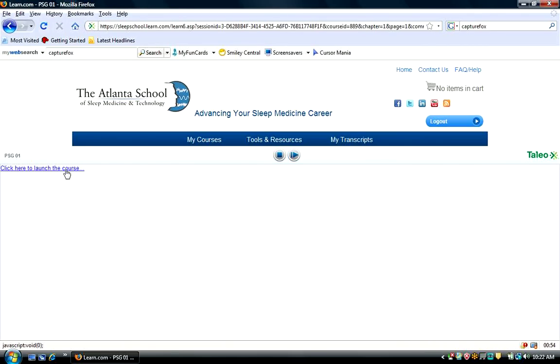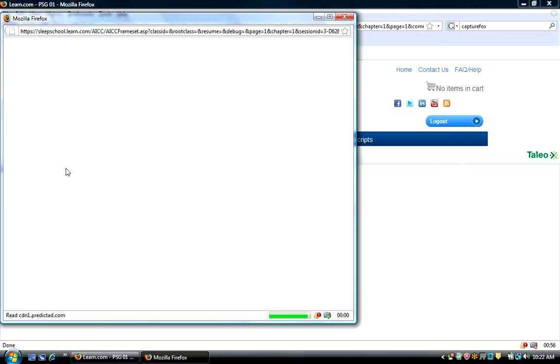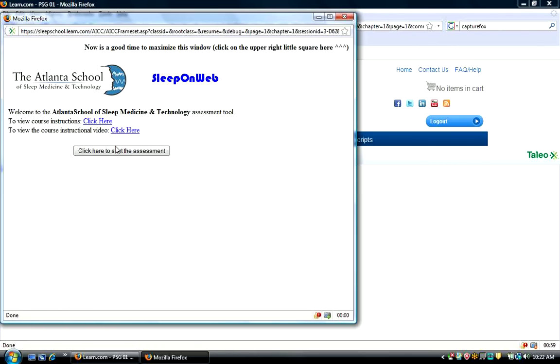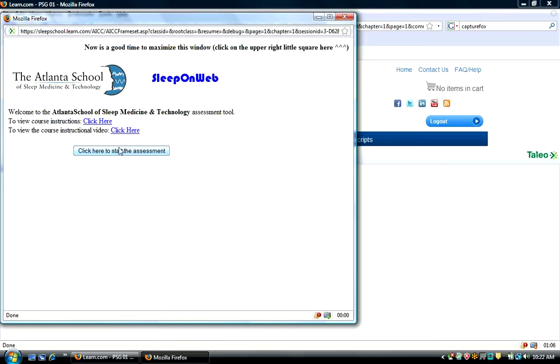I'll click here to launch the course, and if I want to review the written instructions, I would click here, and to view the video again, I would just click right there. So, I'm going to start the assessment looking at the PSGs, clicking here.